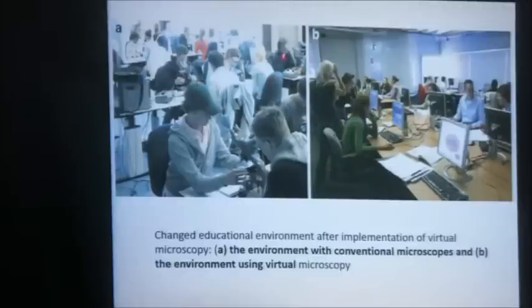You can have one section and your colleague have another section that's different, like these. And now this is prohibited because of COVID-19. Compare this with this nice environment where you have computers. You can have the same section, and all these students can see the same section at the same time using a single slide.